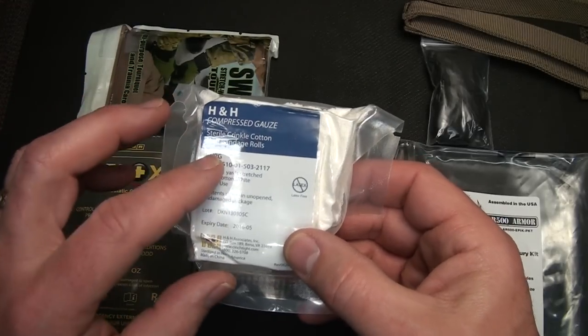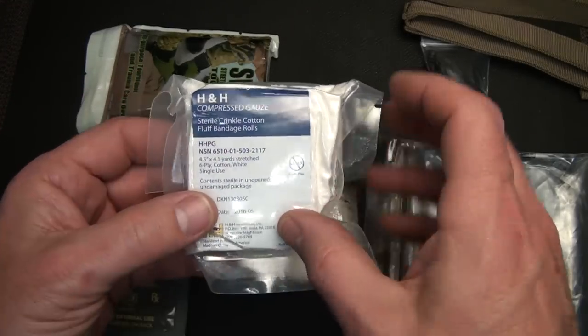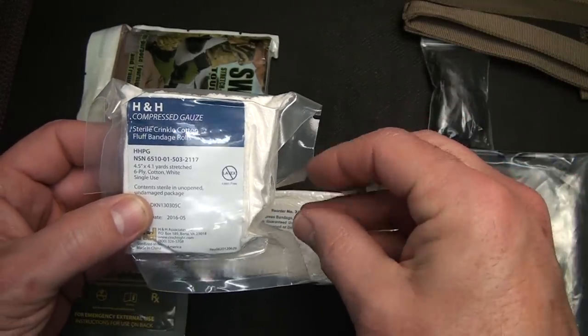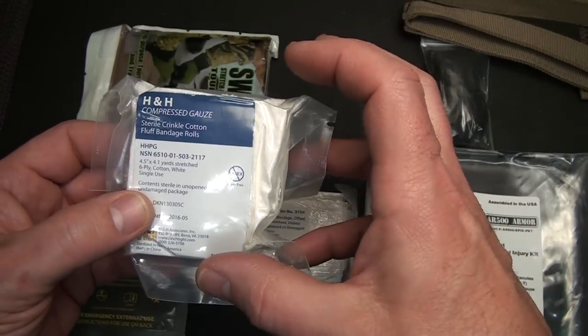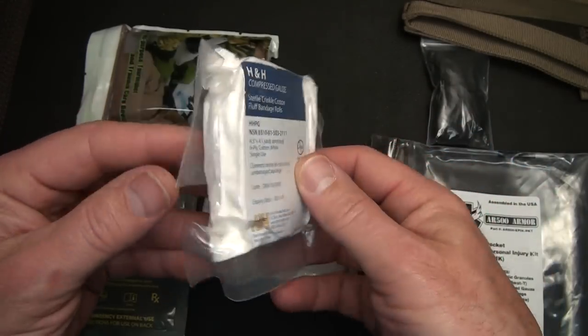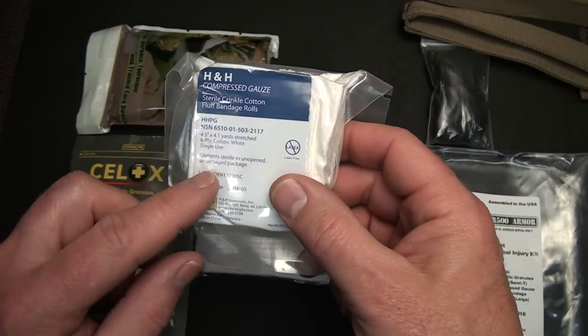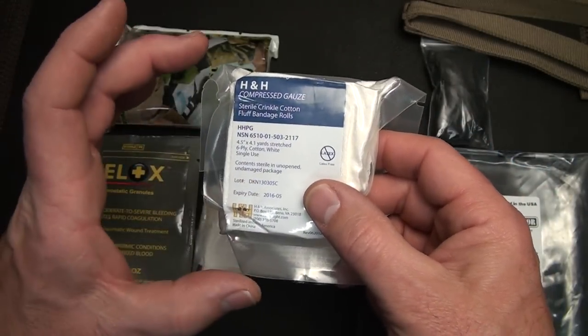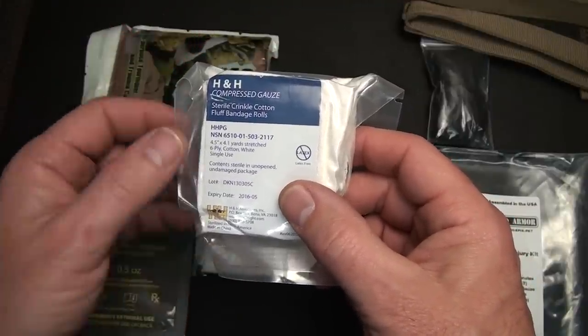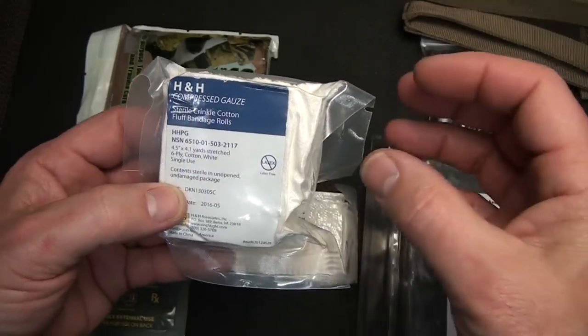And then we have some of the H&H compressed gauze. And this just unrolls and pulls loose, and you pack this into the wound. And this also keeps the bleeding down. It packs it in, and you just continue to stuff it in as much as possible. It's a pretty big piece. It's 4.5 inches wide, but it's 4.1 yards long stretched. It's a 6-ply cotton, and it fits down in.